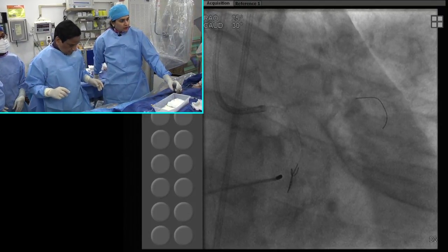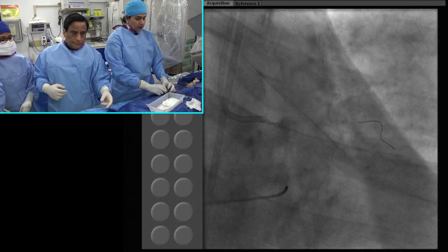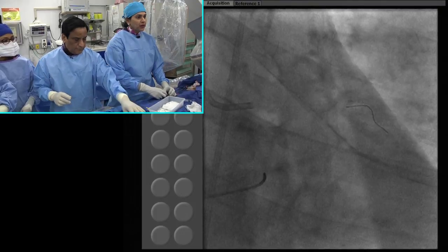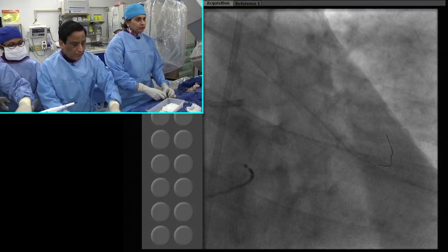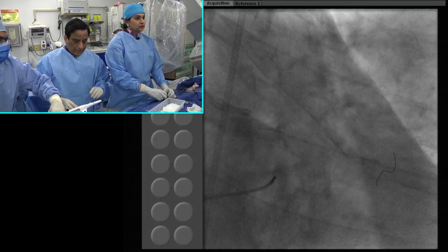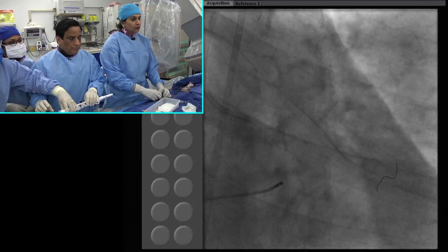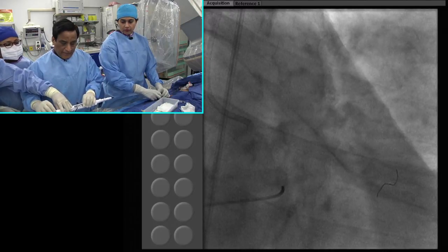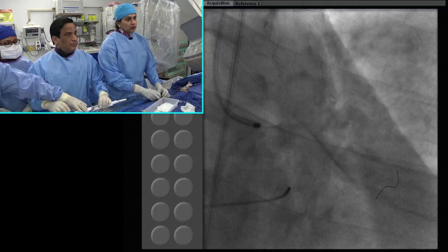Good. Okay, good. So ACT is about 330 on Angiomax, the patient has been on Plavix and PRU is 180. With this age of 80, I think if they are doing well on clopidogrel, it will probably be the best drug in my opinion, having lower bleeding. But clearly in complex cases you definitely want optimal antiplatelet therapy and you want to be sure that clopidogrel is effective based on the PRU.